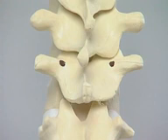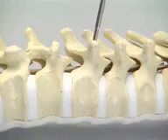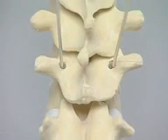Identify and mark the surface projection of the pedicle, and use the pedicle awl and pedicle probe to prepare the screw track. The caudal angulation can be seen, and the K-wires demonstrate less than 10 degrees convergence towards the midline.